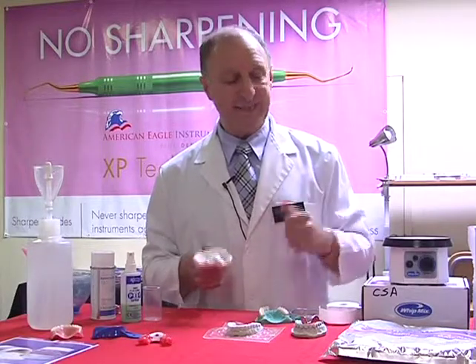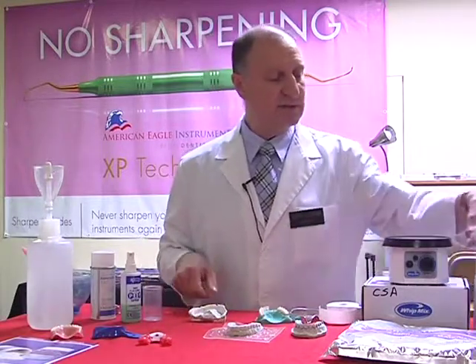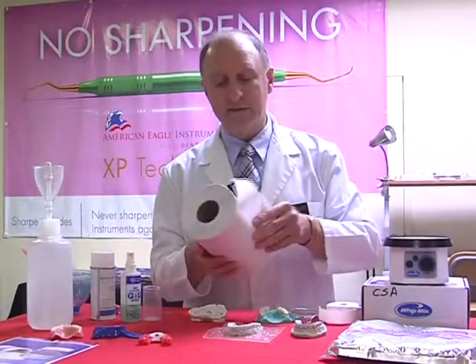Now, in order to keep that accuracy, what most people would normally do is take hold of paper towels, Kleenex, etc.